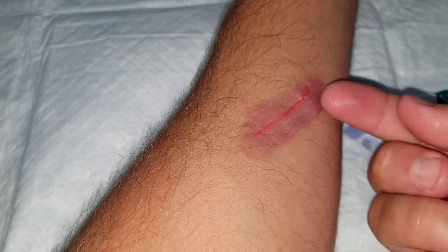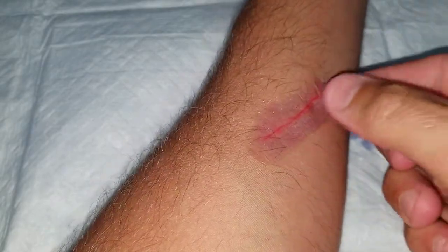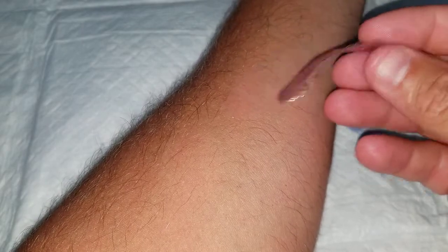So what I do now that I have a bubble on the side, I'll be able to get a fingernail up underneath that and pop it loose. You see there? And then from there, I just slowly work my fingers underneath it to remove it. And not only has it removed the glue, but it has also removed my fake wound.